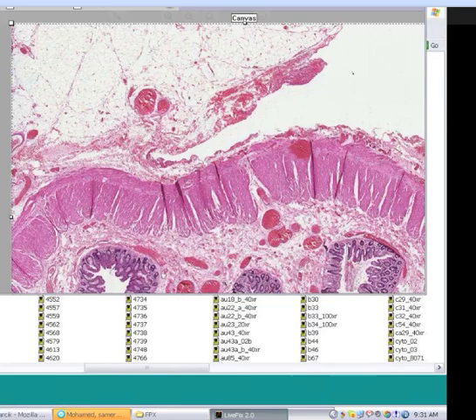So you've identified the mucosa, then you look at the submucosa and you say, is it uniform and loose? Does every part of the submucosa more or less look like every other part? Then you go down and look at the muscularis. Is it of relatively uniform thickness? Does it have inflammatory cells between the fibers? Can I see little separation sometimes between the circular and longitudinal or oblique layers?